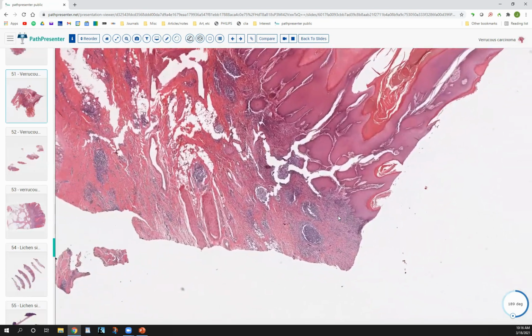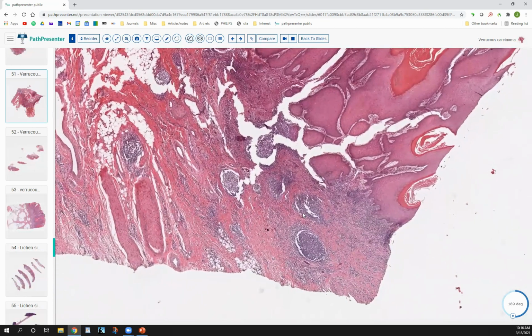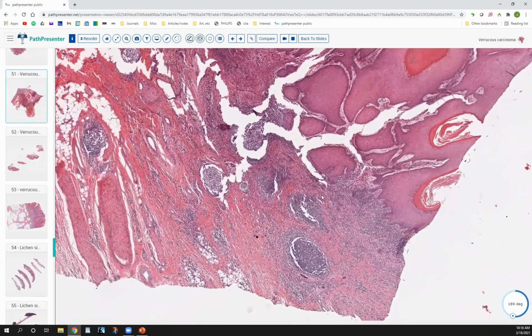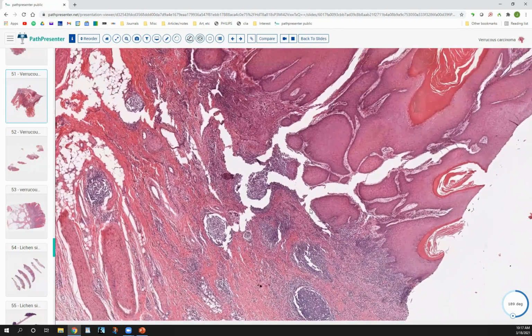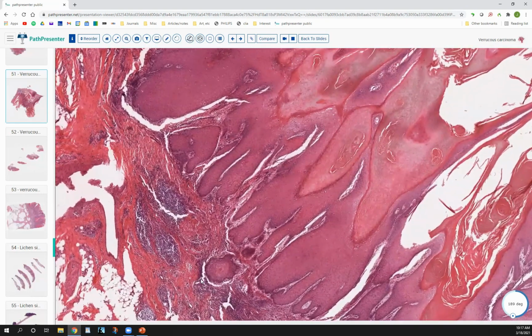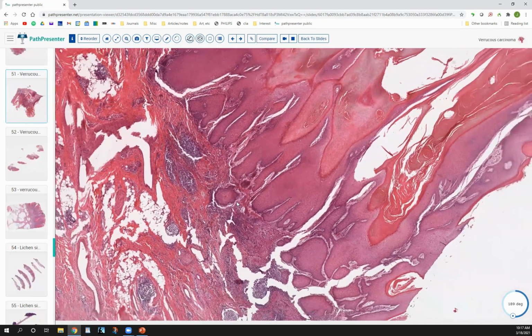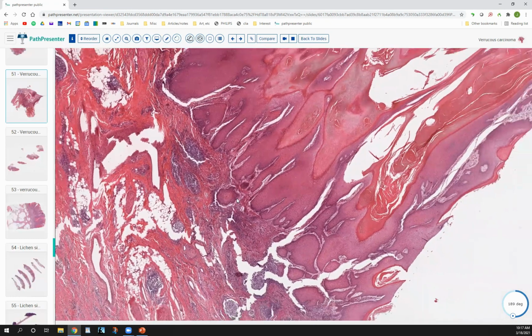There are little patches of lymphocytic inflammation. There's this saying that the lymphocytes are quicker at finding the cancer than the pathologist. So it's not 100%. If you see lymphocytes, start to think about whether something is really benign or not. But it's not always the case. But in this case, you do have such an extensive downgrowth. You see this right here. It's what I call bulldozing its way down into the dermis, that you have to think about verrucous carcinoma, which is what this is.